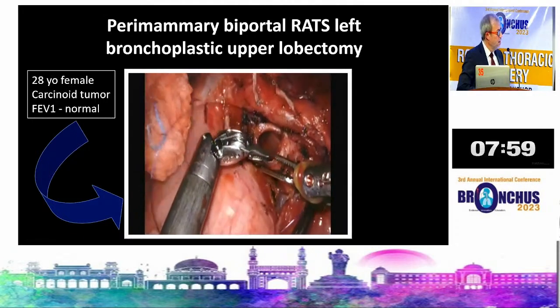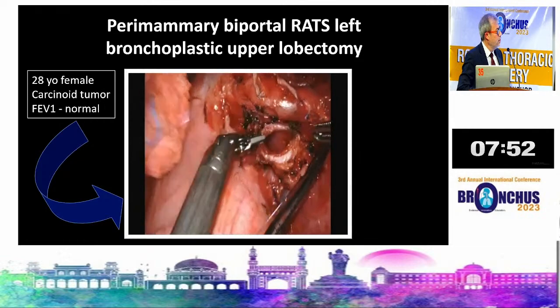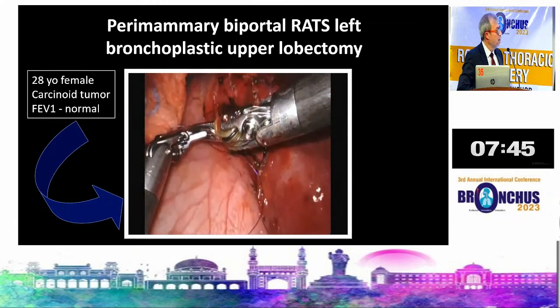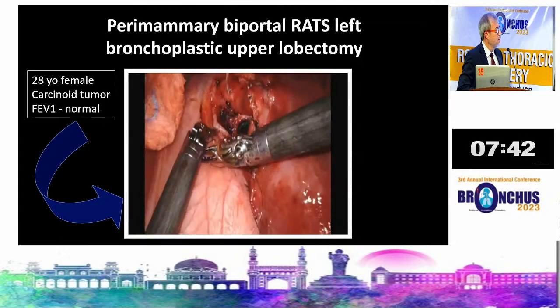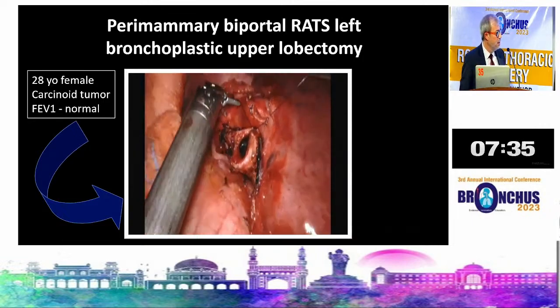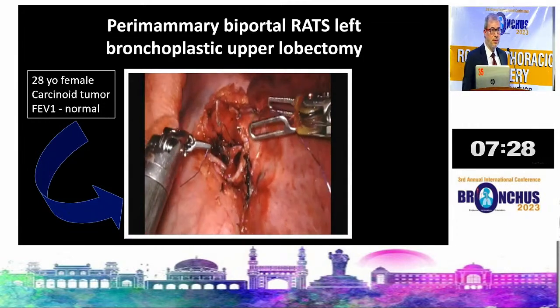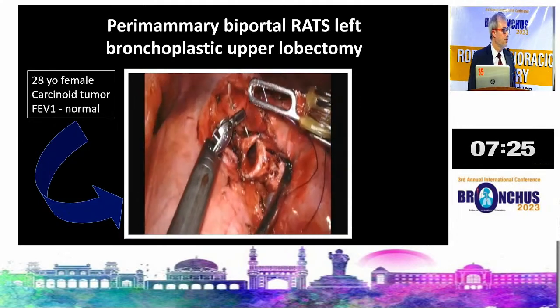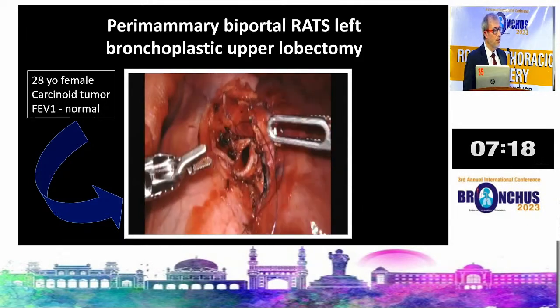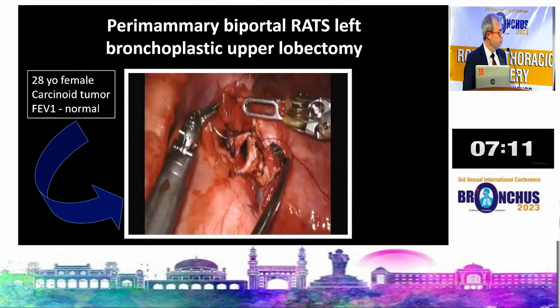Then we proceed to the suture of the bronchus. You see the versatility of the robot to do the suture. One arm can be anterior, and we use the posterior for the second arm. It's pretty easy to do the running suture. I can say it's easier than with the regular approach, because of the bending of the robot, the versatility, maneuverability, exposure. As you can see, in the primary approach, we have the hilum just in front of the camera. So that's why the view is very similar to the view that we have by the regular approach.